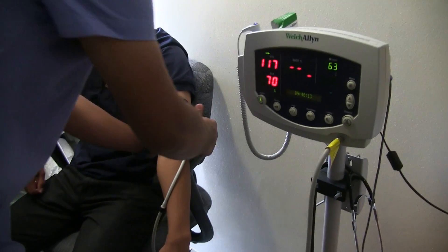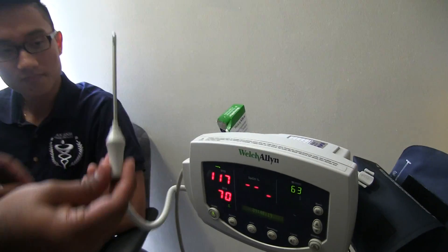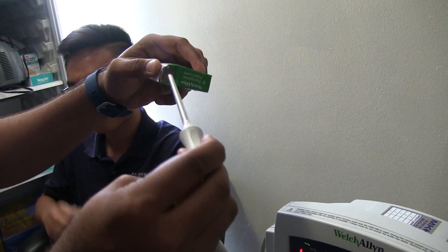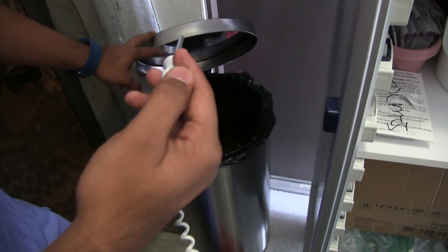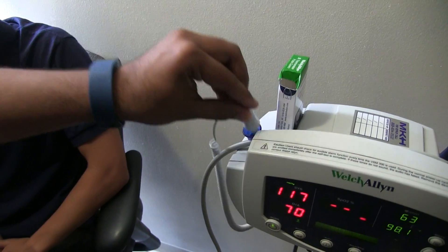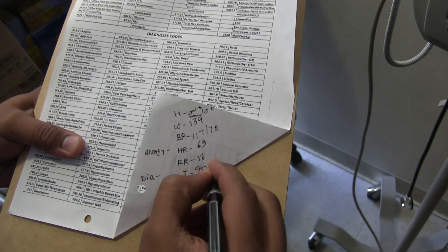Next, remove the cuff and measure their temperature. Take out the thermometer and place a thermometer cover on it. Ask the patient to place it under their tongue and close their mouth. On the machine you can see it measuring the temperature — it reads 98.1. Dispose of the thermometer cover by clicking the button to release it into the trash. Then write down the values onto the chart.